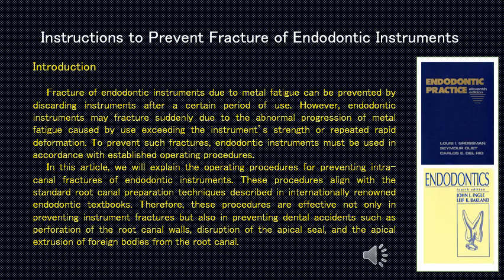Introduction. Fracture of endodontic instruments due to metal fatigue can be prevented by discarding instruments after a certain period of use. However, endodontic instruments may fracture suddenly due to the abnormal progression of metal fatigue caused by use exceeding the instrument strength or repeated rapid deformation. To prevent such fractures, endodontic instruments must be used in accordance with established operating procedures. In this article, we will explain the operating procedures for preventing intracanal fractures of endodontic instruments.